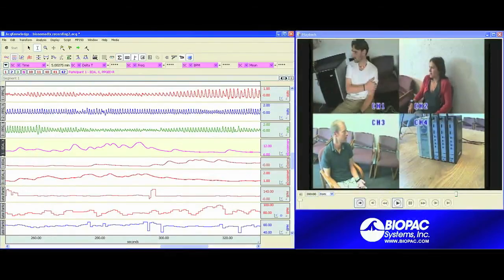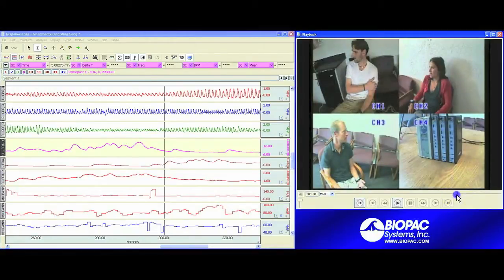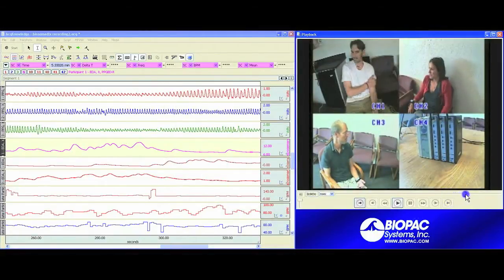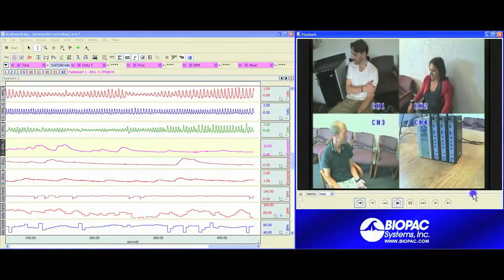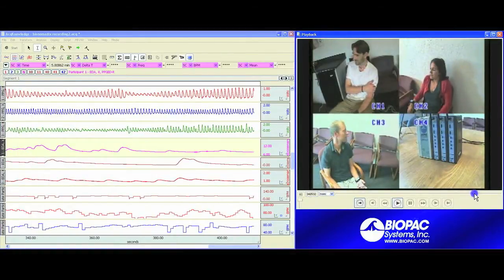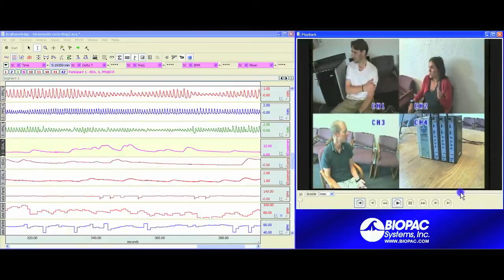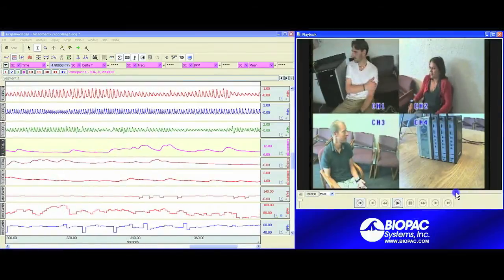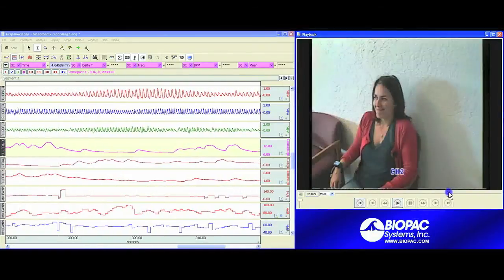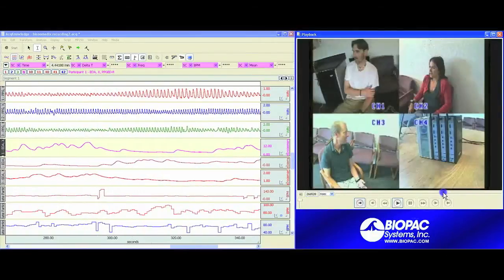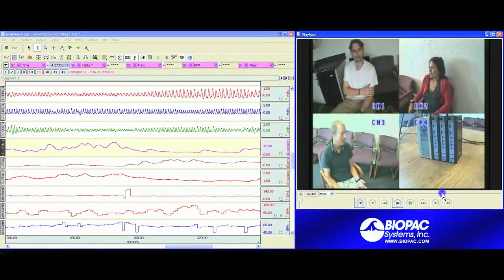Another way of taking a look at the data is simply to just grab the scroll bar on the playback viewer and scroll through. This way, we'll scroll through both our physiological data and the video so we can take a look at what's happening in both, and then we can stop and further investigate any areas of interest.